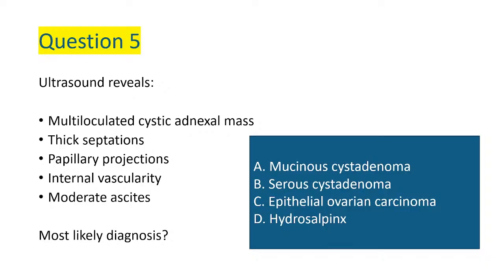Look at this. What do you think this is? Ovarian mass that is multiloculated with papillary projections and internal vascularity, these are typical of malignant transformation. So in terms of epithelial tumors, can you see what is carcinoma, which is C. If you see a cystadenoma, it is benign.